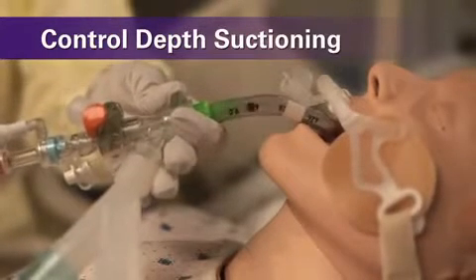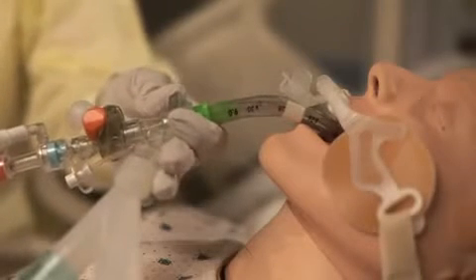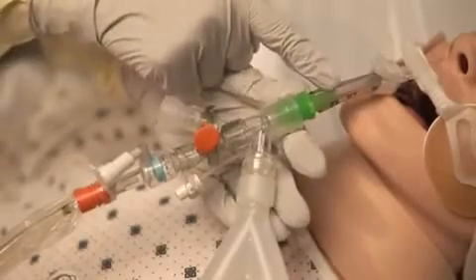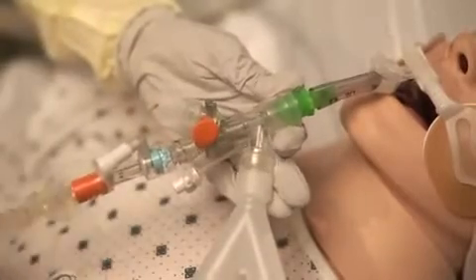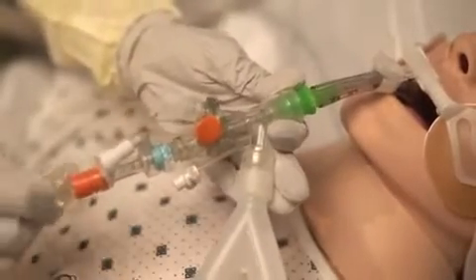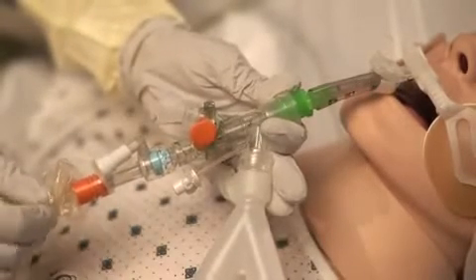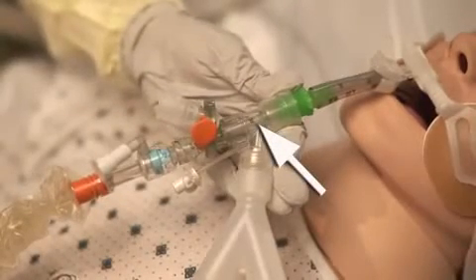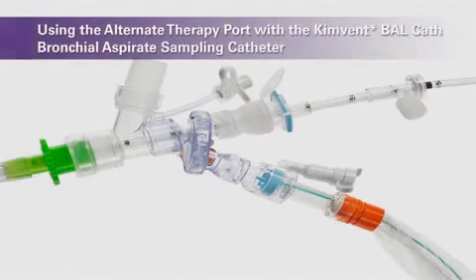Align any printed depth number on the catheter with the similar number printed on the endotracheal tube. In this case, 30 centimeters on the catheter will line up with 30 centimeters on the endotracheal tube. Or, observe the printed number on the endotracheal tube closest to the endotracheal tube adapter. Add 6 centimeters. In this case, 30 centimeters on the endotracheal tube plus 6 centimeters equals 36 centimeters. Advance the catheter until the sum appears in the window of the KimVent MAP closed suction manifold. The catheter tip will be within 1 centimeter of the end of the artificial airway.